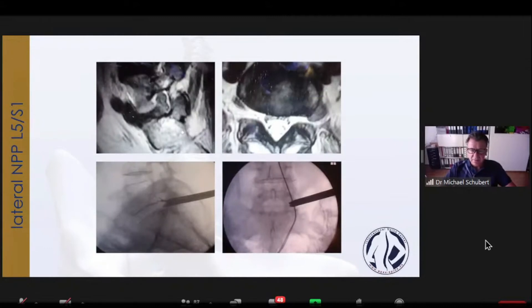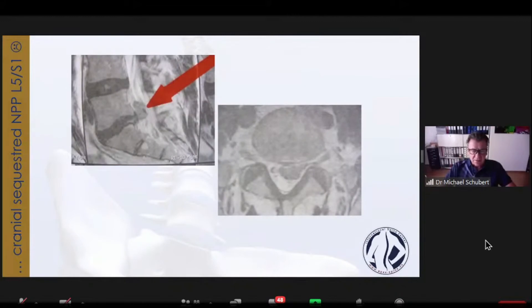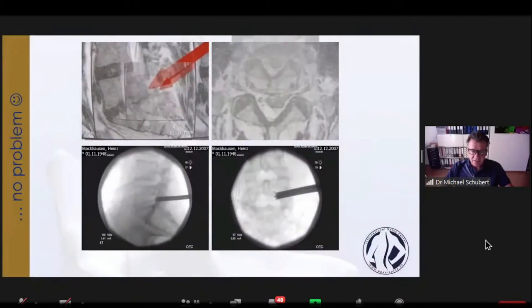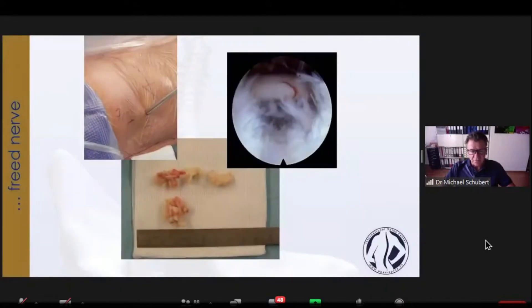Here again, an intra-extra foraminal disc herniation at level L5-S1 with control of the forceps, and here the picture shows the freed nerve root and the removed disc herniation. This is a case from a long time ago — a patient with a cranially sequestrated L5-S1 disc herniation. Some colleagues think you have to do a transiliacal approach; for me there is no need. I removed this herniation transforaminally as well. Here you see the control of the forceps — I'm at the right spot. The approach at level L5-S1 is around 10-12 centimeters lateral, and this is the reason why I could reach the cranially sequestrated disc herniation.